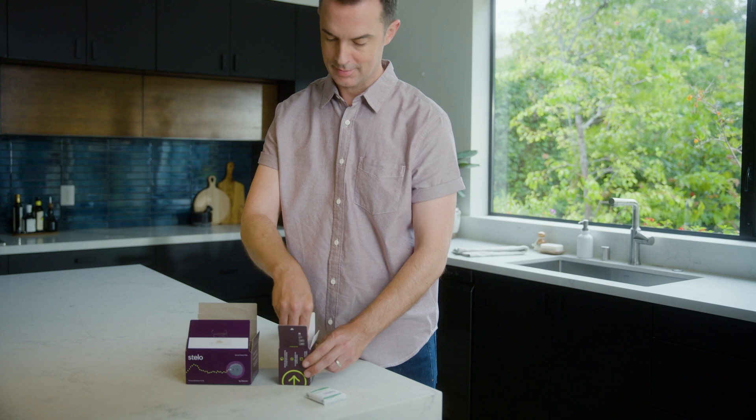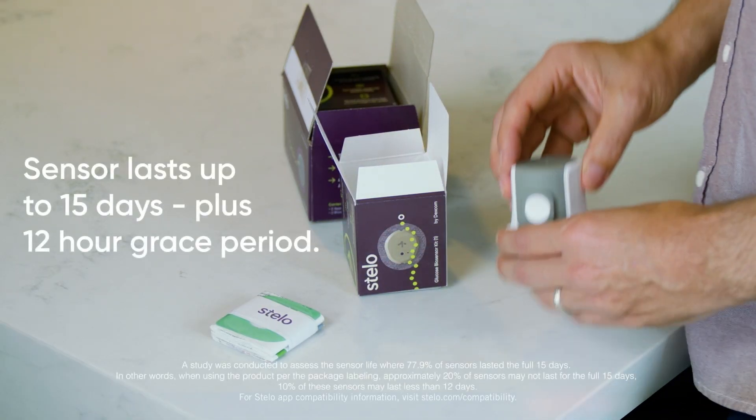It's easy to get up and running with Stello. Let me take just a couple of minutes and show you how. Time to unbox your Stello. You should have an overpatch bundled with some instructions and a sensor.